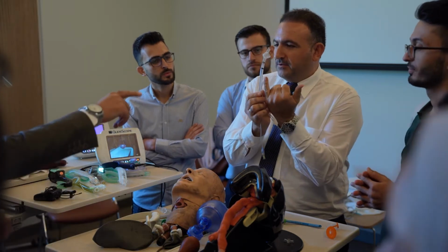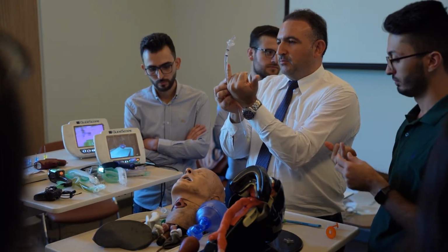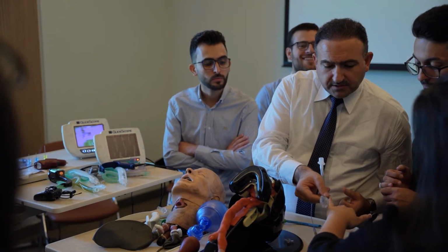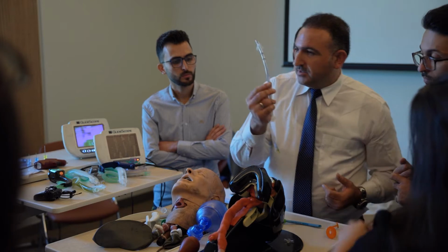At which point do we compare it? It's the same diameter. Okay, I got it. This one is very small for me. Is it accurate enough? It's acceptable, and you use it because we need time. We don't have time to waste. So yes, this is the proper size for her.